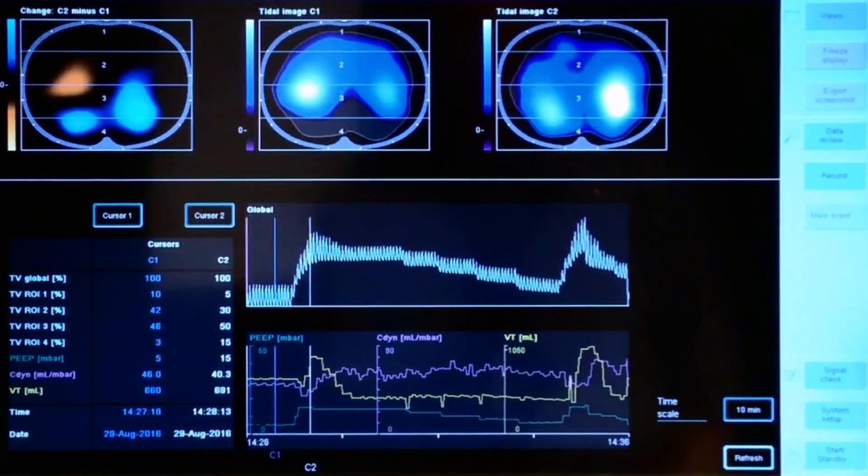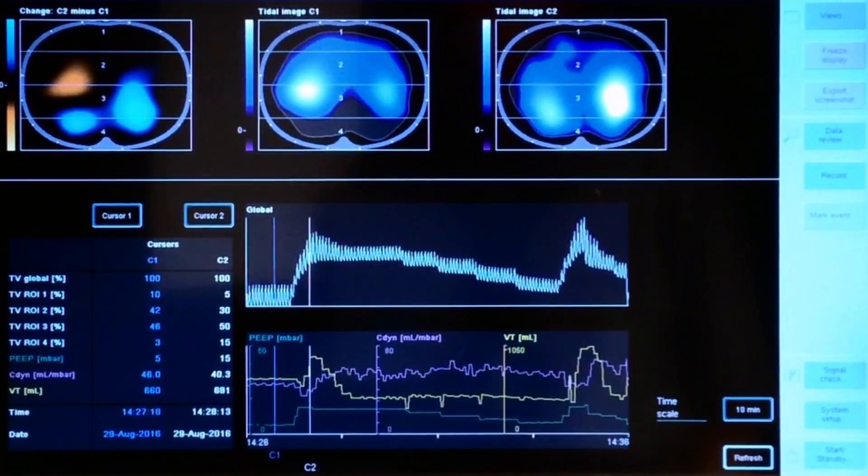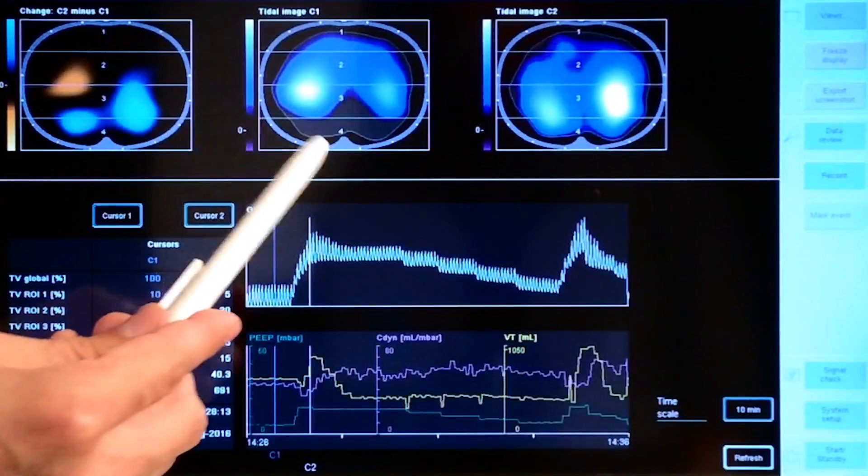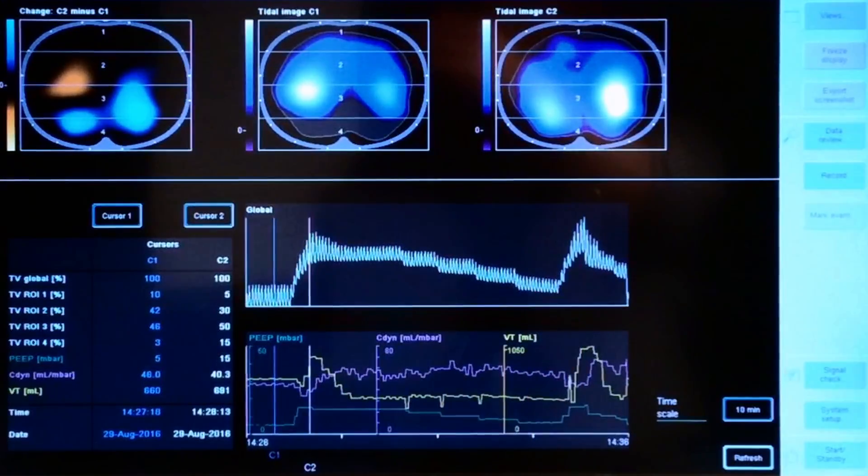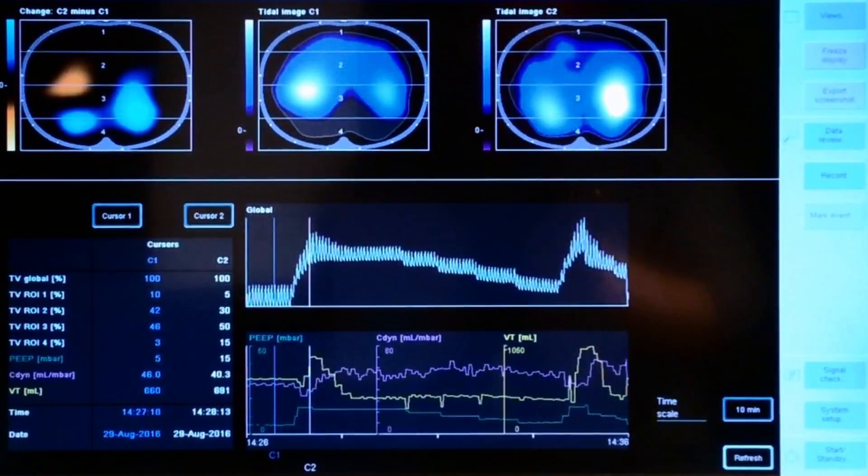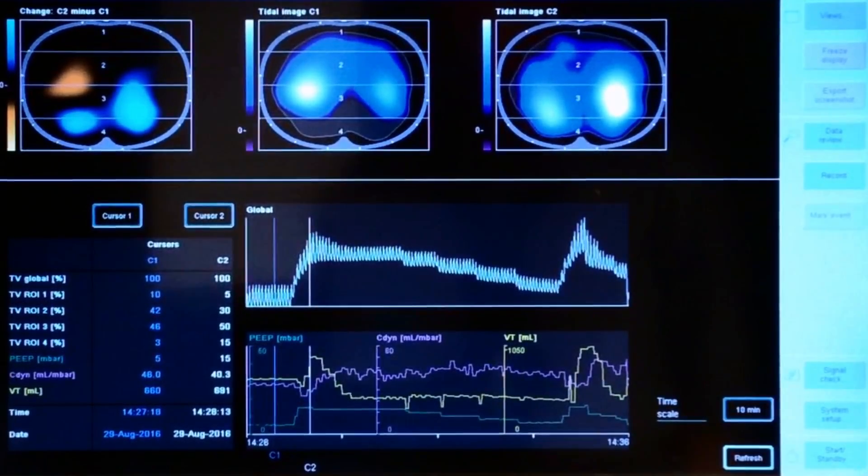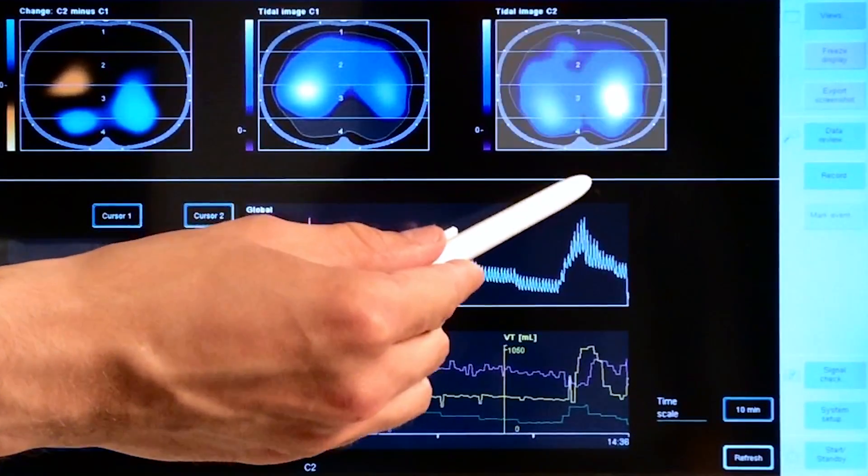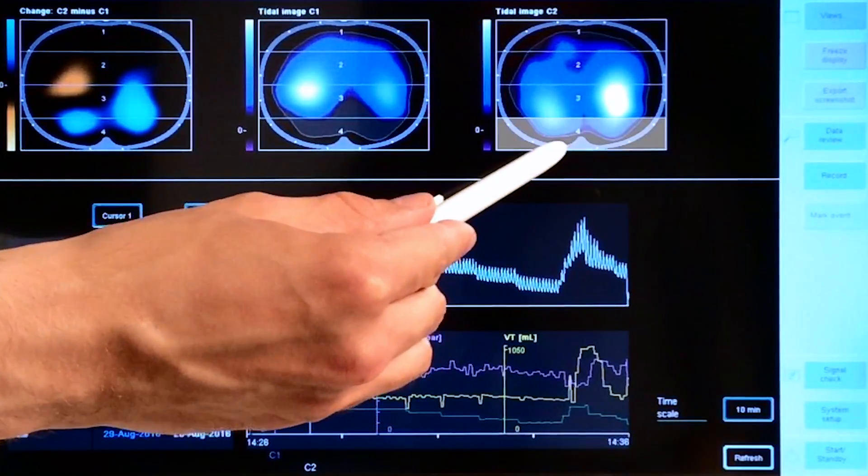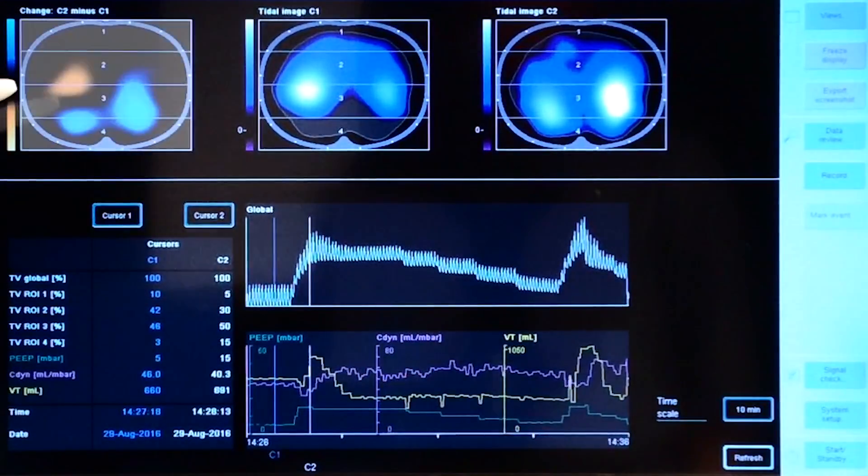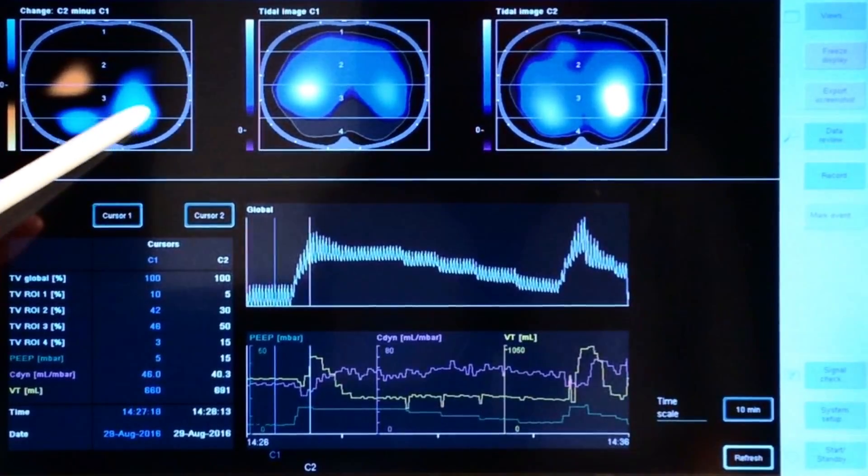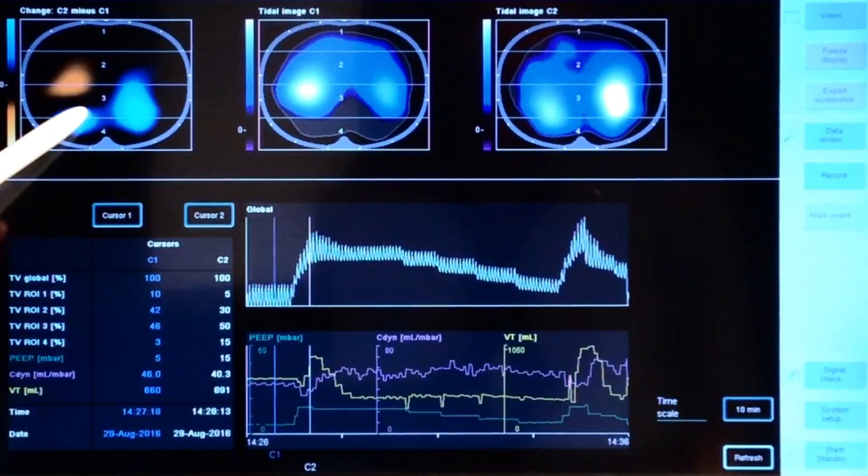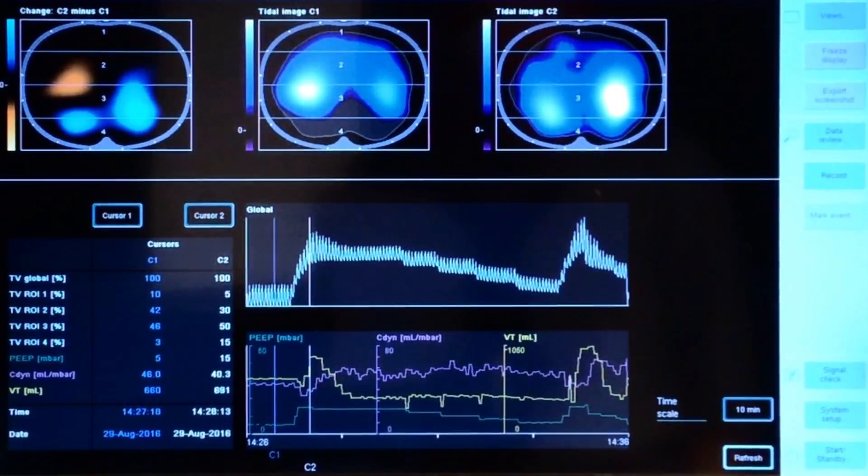When we compare the regional information before and during the recruitment maneuver, we see a significant change in the images. The tidal image now shows ventilation in region of interest number four. The differential image also shows blue color in this region, indicating a gain of ventilation.